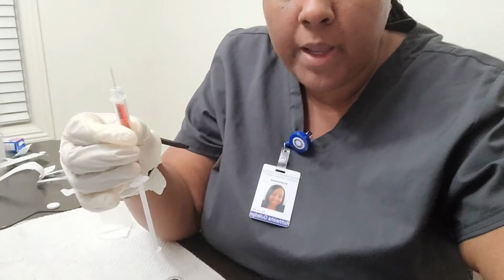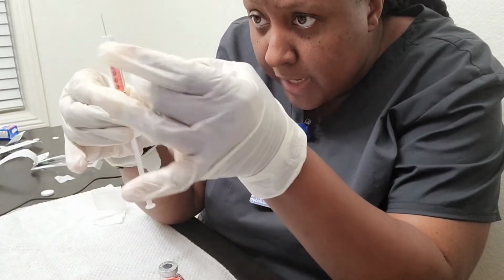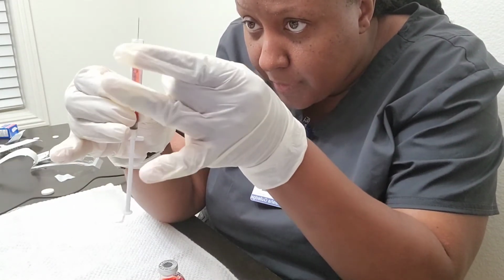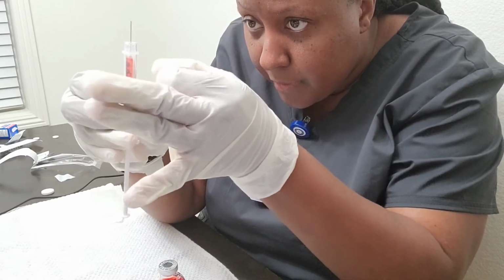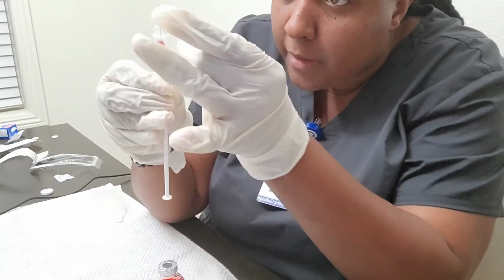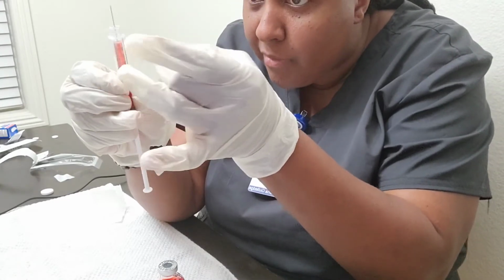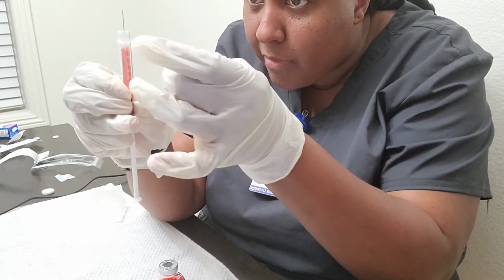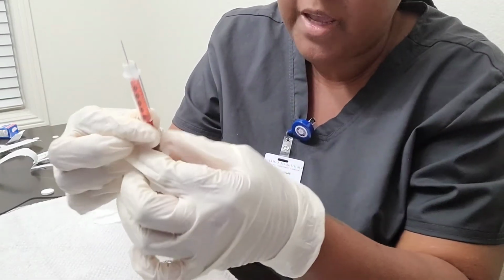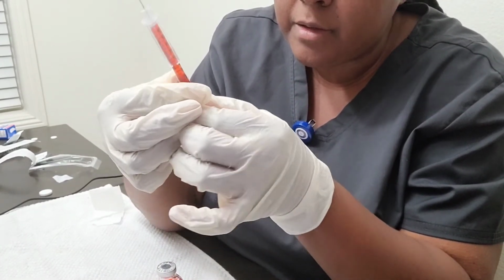Okay, so then I will go ahead and look for any air bubbles, and then I will tap them out. Okay, so I have now 1 milliliter.